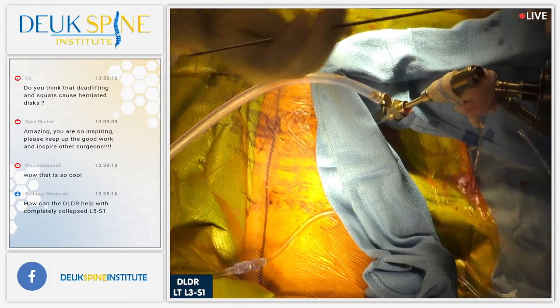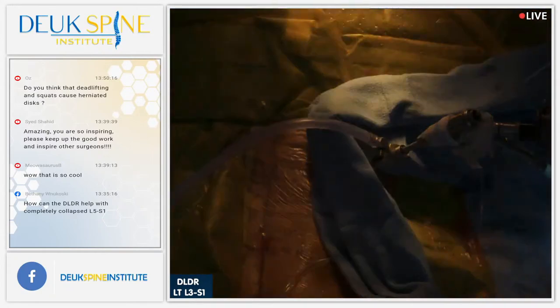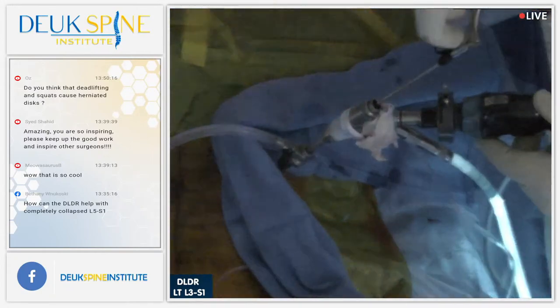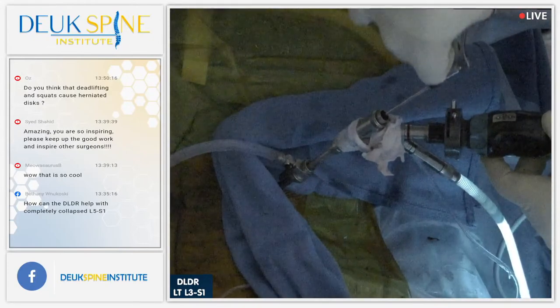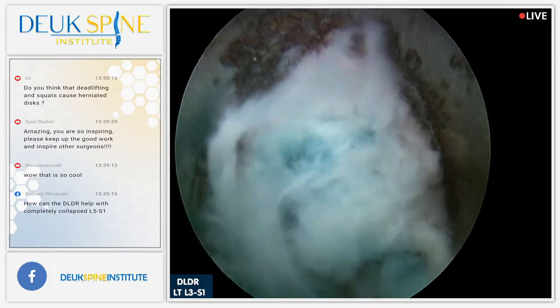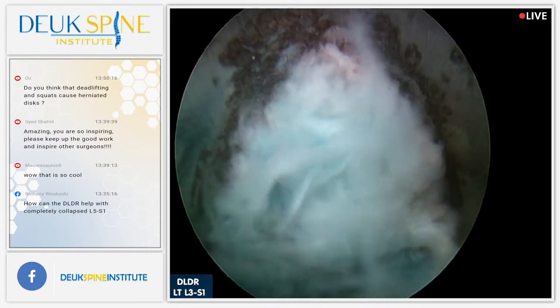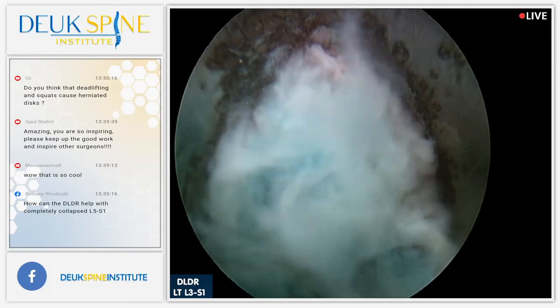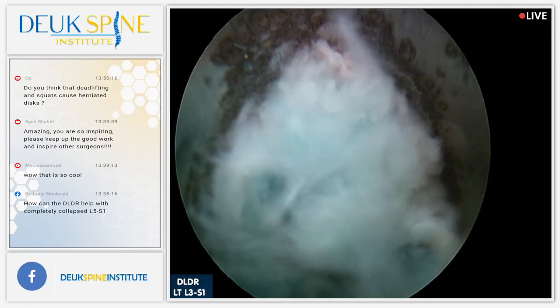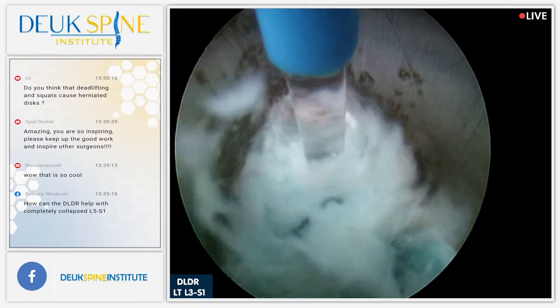All right, so this will be our last disc. This is the most painful of the three based on his discogram. You can see how fresh the herniation is. It's a fluffy blue and white. That just means that it's recent. We'll be done in 10 minutes, doctor. Now let's get in there and get it done.